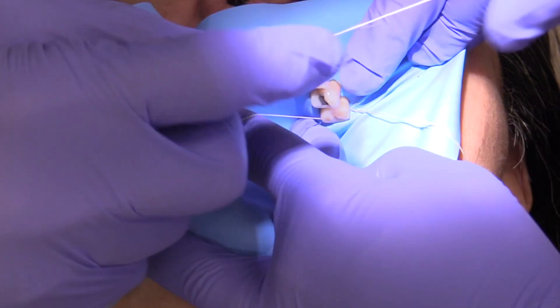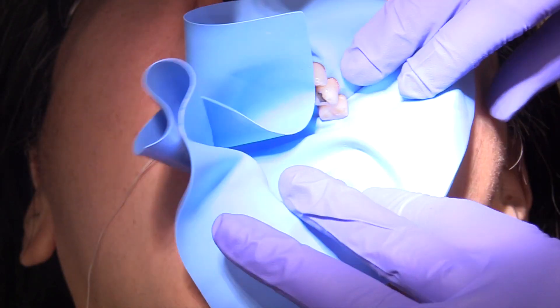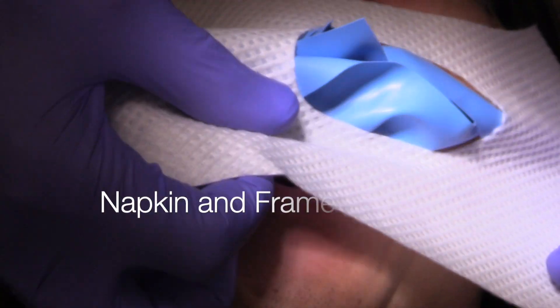Your chairside assistance is going to really help out the situation here. And there's the final tooth placement — I went all the way over to tooth number 13 today.